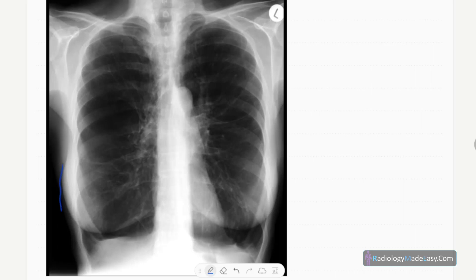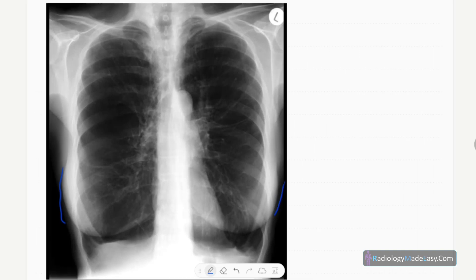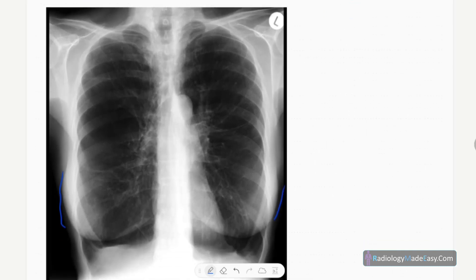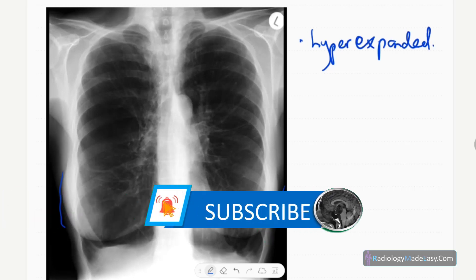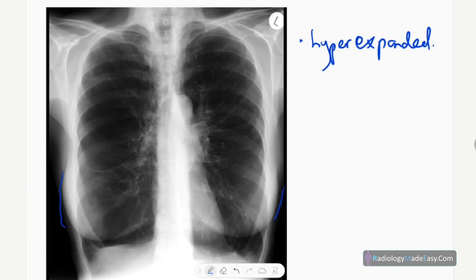You can see the breast shadows, confirming this is a female patient. The chest is hyper-expanded and hyper-inflated. Posteriorly, you can count one through eleven ribs — 11 posterior ribs visible, which confirms a hyper-expanded, hyper-inflated chest.